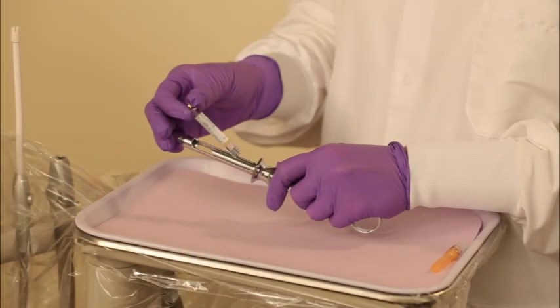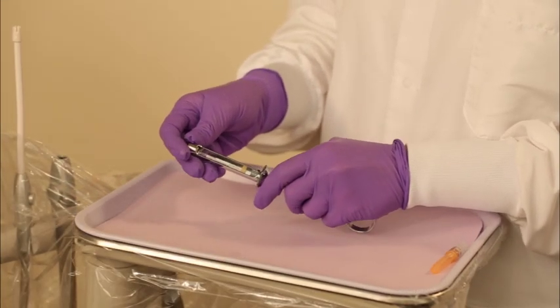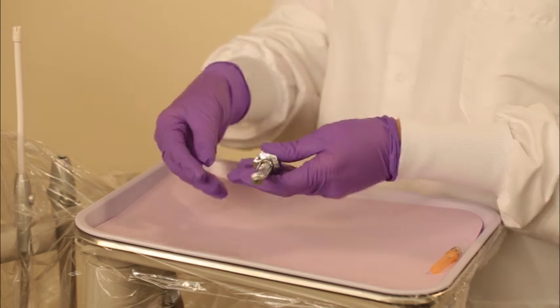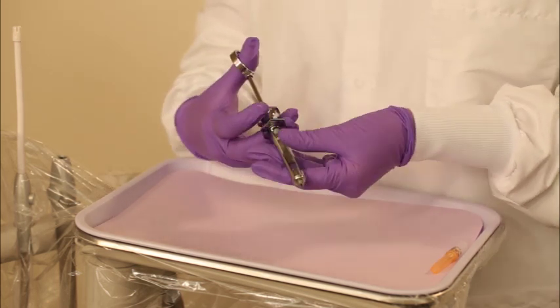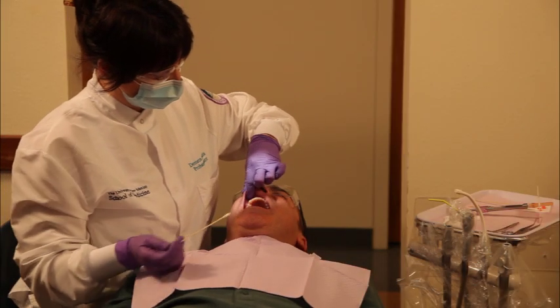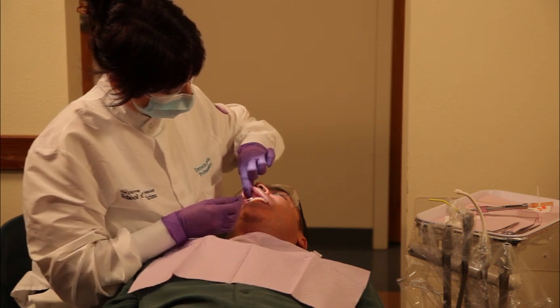Load the local anesthetic syringe as demonstrated in the procedure loading the metallic or plastic cartridge type syringe. Before injection, follow all steps as demonstrated in the procedure basic injection technique. Assume the correct operator position for a right-handed clinician at 8 o'clock, right side, or 9 o'clock, left side, or a left-handed clinician at 4 o'clock, right side, or 3 o'clock, left side.